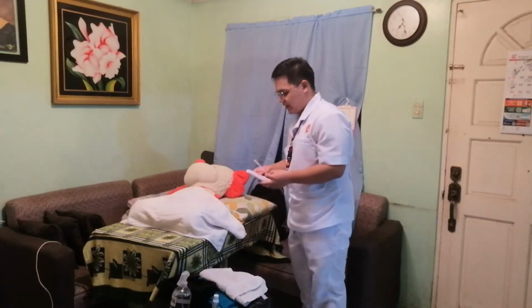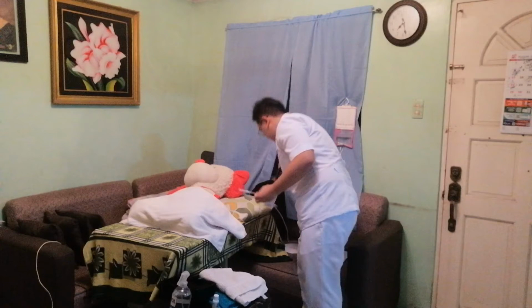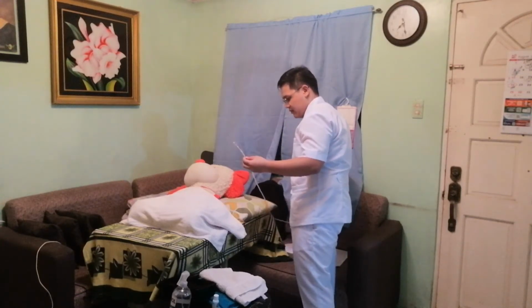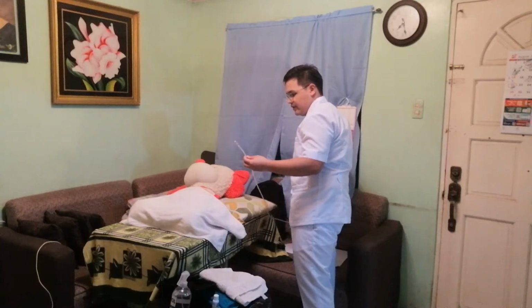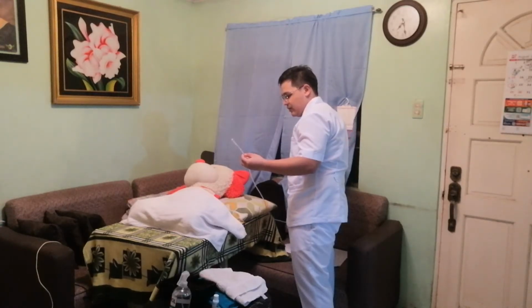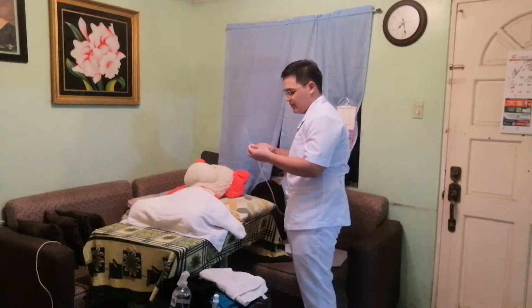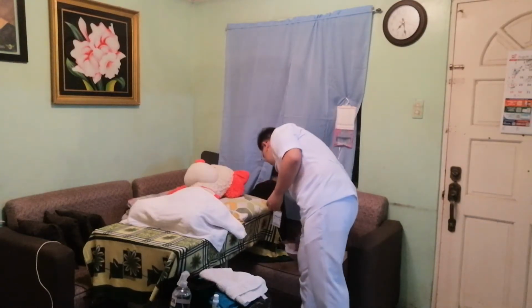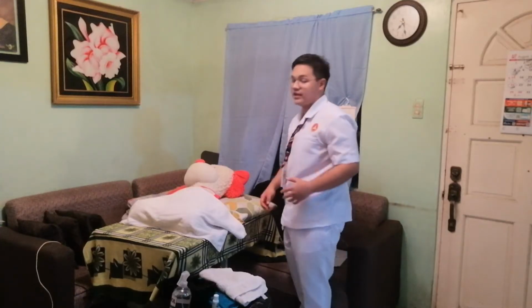So for example, we have run the solution. Okay, so we have already removed the bubbles from the tube. Okay, we will now be clamping it. Okay, and we will be placing it on the disposable towel.